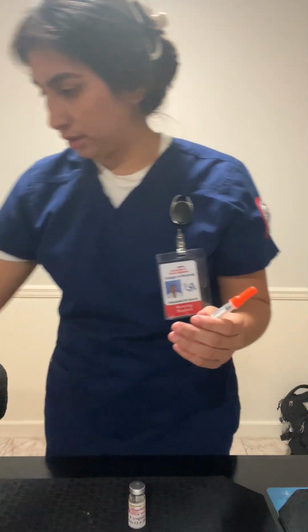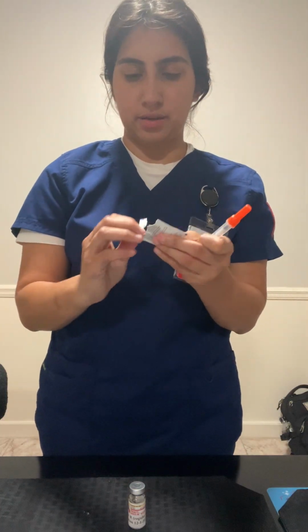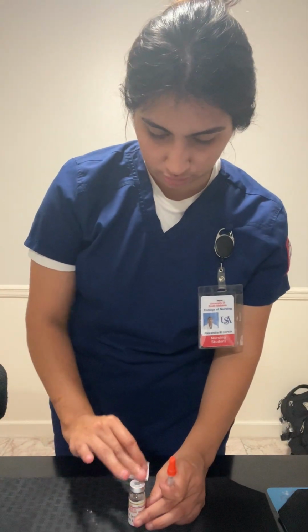And I'm going to grab an alcohol pad and clean my vial, hopefully.